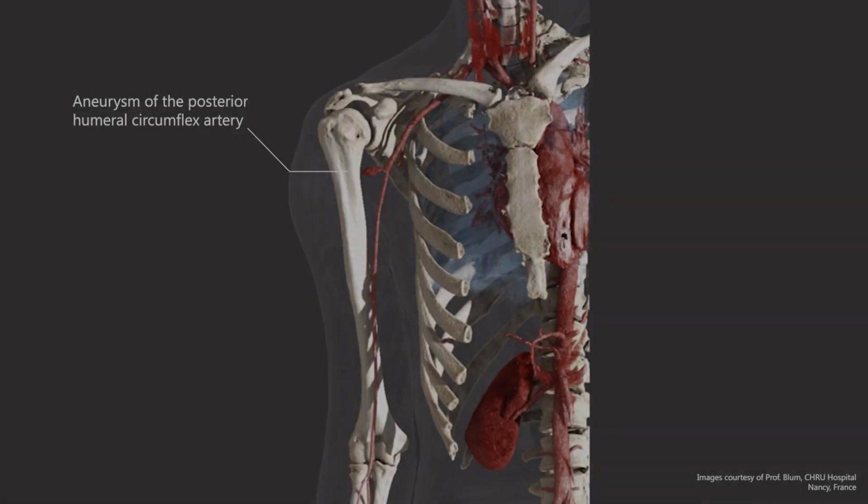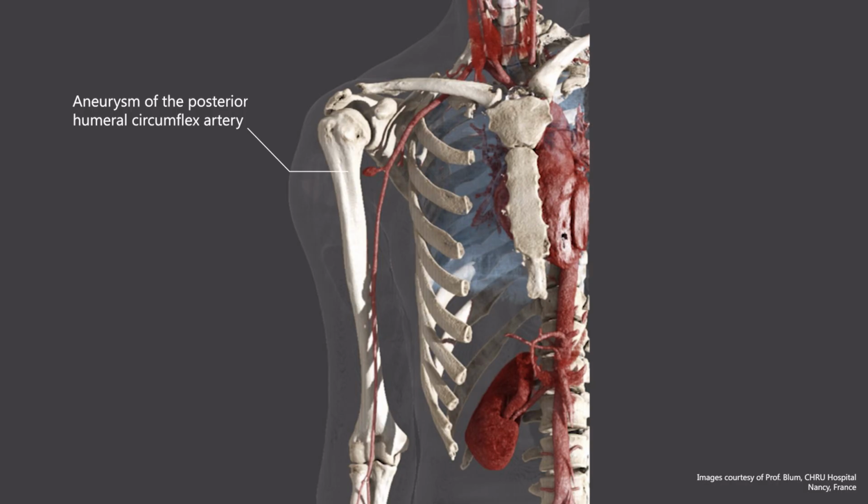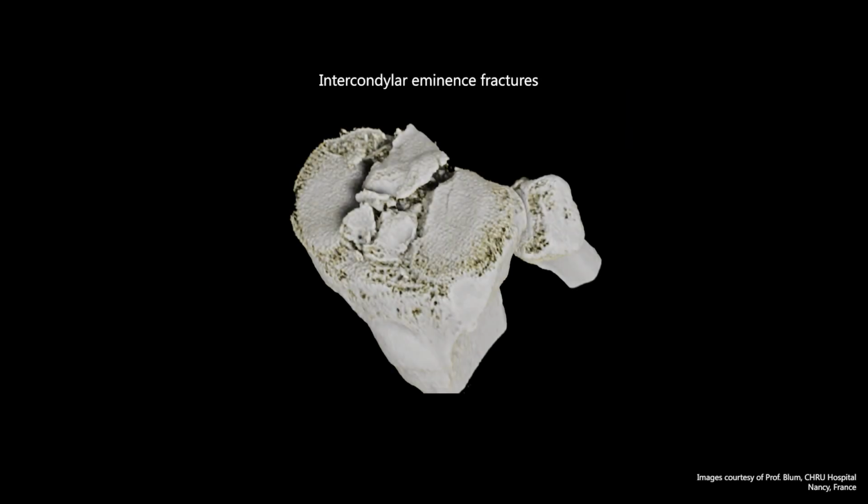Global illumination is a new tool for 3D rendering, which I think will replace volume rendering techniques. It has many advantages compared to the volume rendering technique, VRT, because it provides photorealistic images with a better perception of the depth of the tissues, of the fractures, of the small and subtle lesions.